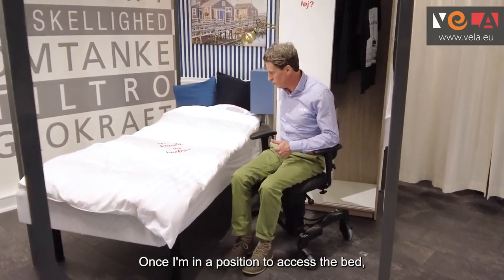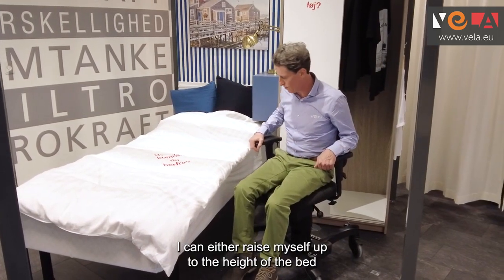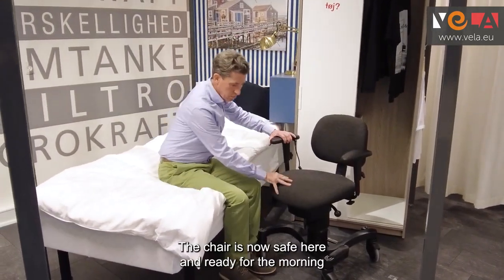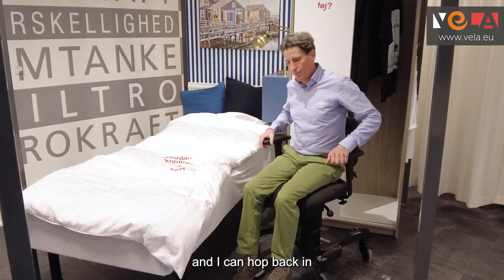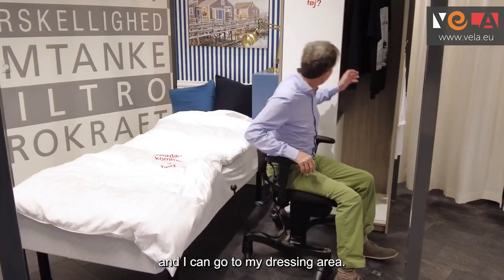Once I'm in a position to access the bed I can again lock the brake, which is nice and stable. I can either raise myself up to the height of the bed and pop myself in. The chair is now safe here ready for the morning, and I can pop back in, lower slightly, release the brake and go to my dressing area.